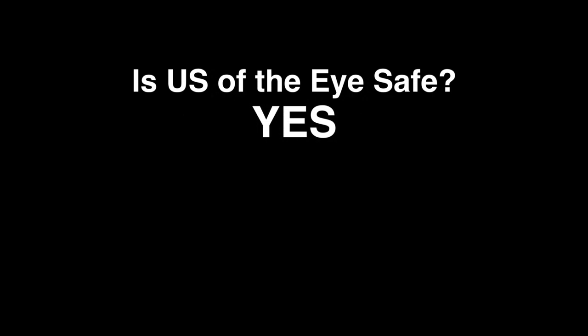So first of all, is ultrasound safe for the eye? Yes, we know it is. But you always have to be careful when scanning anything, and we always want to apply the ALARA principle, stated as low as reasonably achievable, meaning that you would use as little power as possible to ultrasound something.